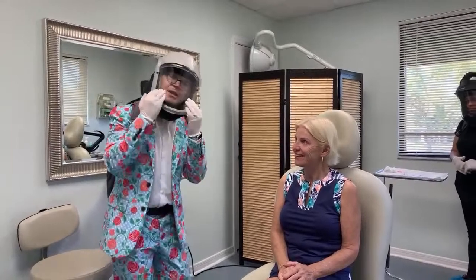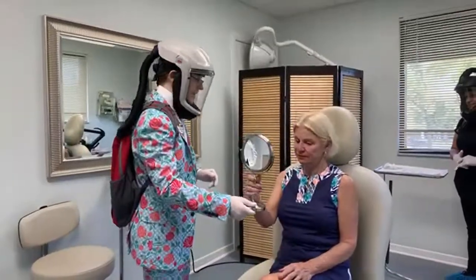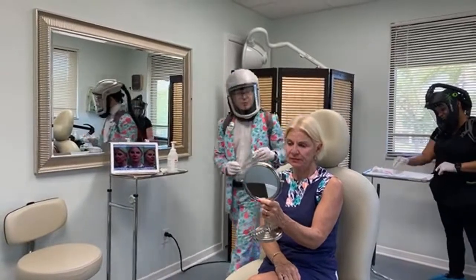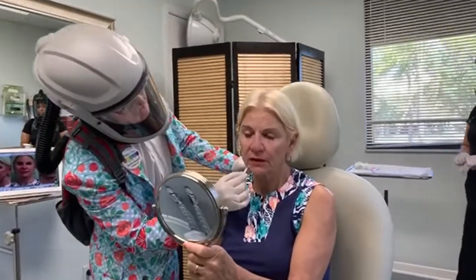Wants to do a little bit of the Bellafill. We're going to focus on the little lines through here. Now, we talked about laser, we talked about tighten. Hold this for me. And the benefit, of course, of doing the Bellafill, there's no downtime, and that is a permanent filler. So today what we discussed is I'm going to thicken the skin through here and try and treat as many of these creases as I can.